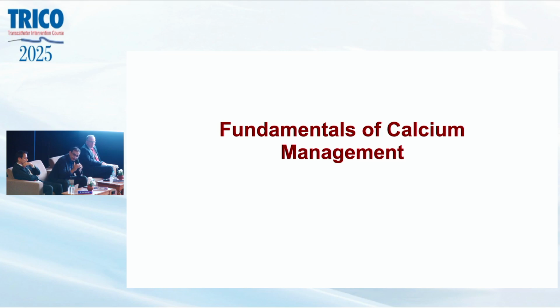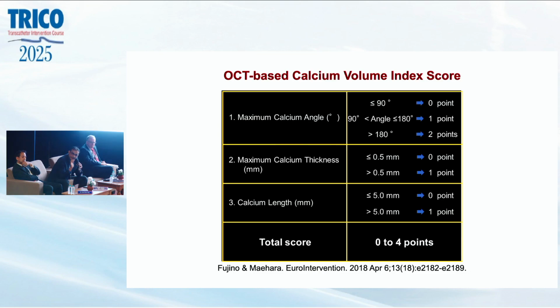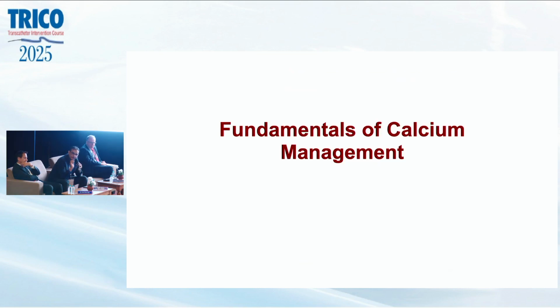However, after the second stage, in spite of whatever protocolization, sometimes you're left with doing a 1:1 non-compliant balloon dilatation in 2 orthogonal views and seeing if it is expanded enough before you actually put in the stent. Sometimes you have to give it up and say, we can't do more than this, back off for safety. I mean, that's just a framework. I'm just outlining what we do.